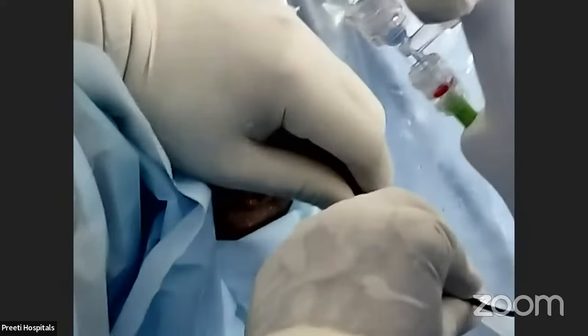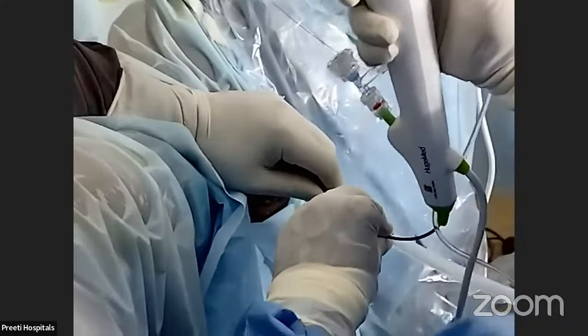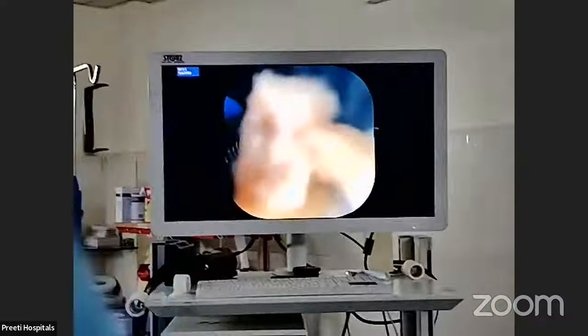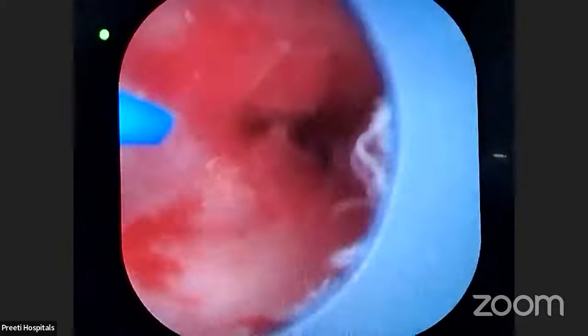See, show how he is holding. He should never slip. That is a disaster. But in this case, if it slips, okay, it comes into the ureter. See, I will put it like this and suck it out. Slowly, I will come out. How much time is it taking? Nothing. It is zero time. In 10 seconds, I will be there inside like this. What happens in 10 seconds if you can see the stone and clear?